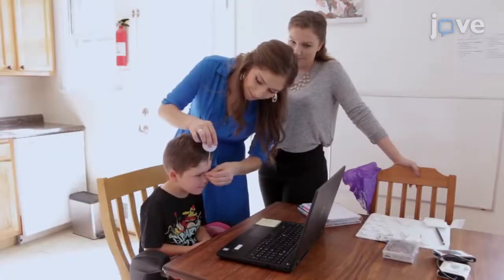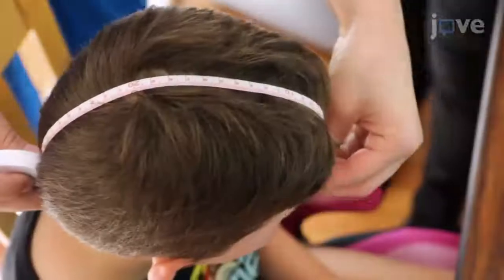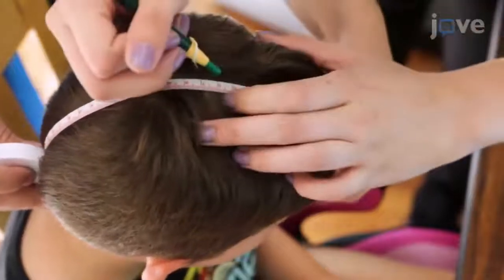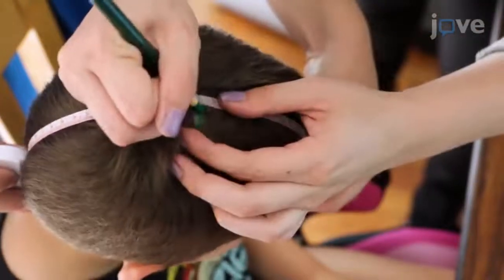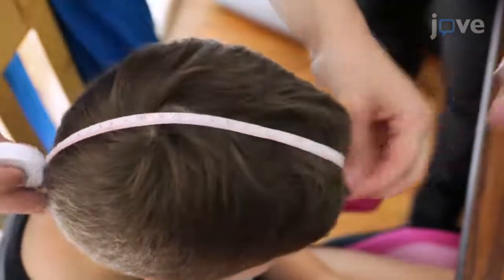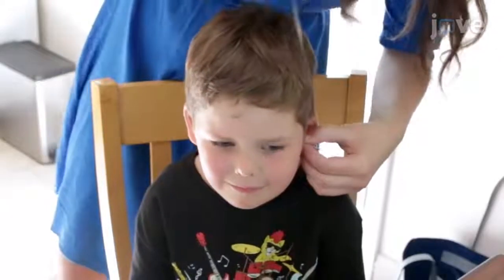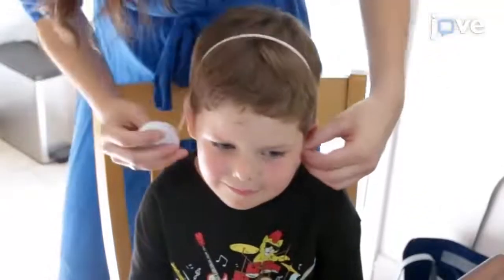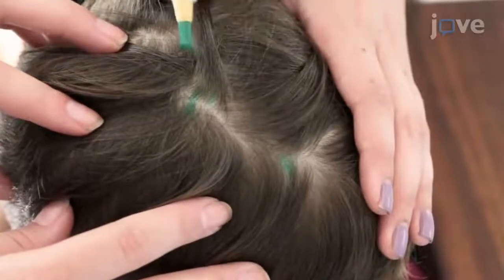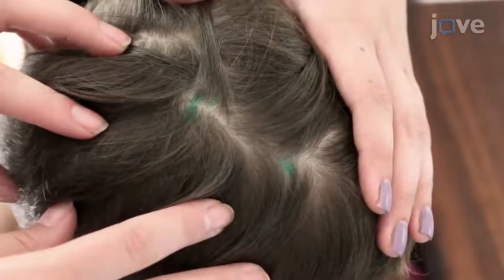Using a flexible tape measure and china marker, measure the distance from the inion to nasion and place a mark at the halfway point. Measure the distance from the preauricular notch on one ear to the preauricular notch on the other ear and place a mark at the halfway point. The intersection of these two marks is the reference point, or CZ.